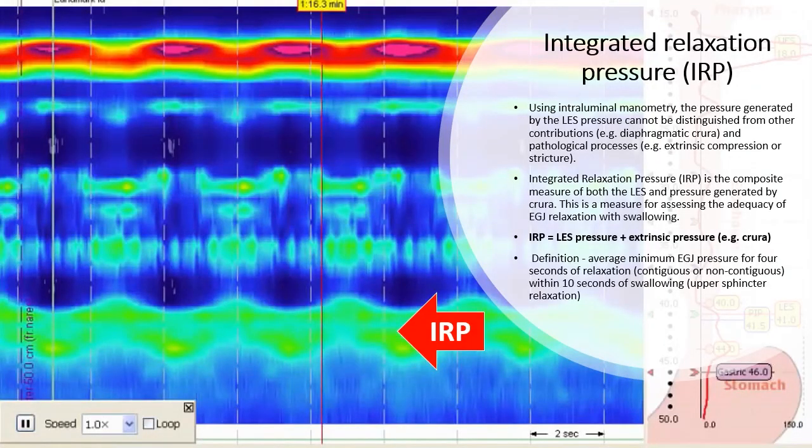Using intraluminal manometry, the pressure generated by the lower esophageal sphincter cannot be distinguished from other contributions like the diaphragmatic crura or pathological processes like extrinsic compression. The integrated relaxation pressure is the composite measure of both the lower esophageal sphincter and the pressure generated by the crura.